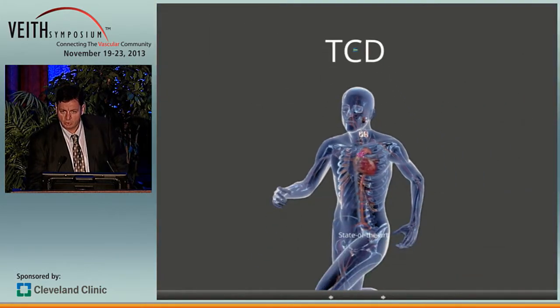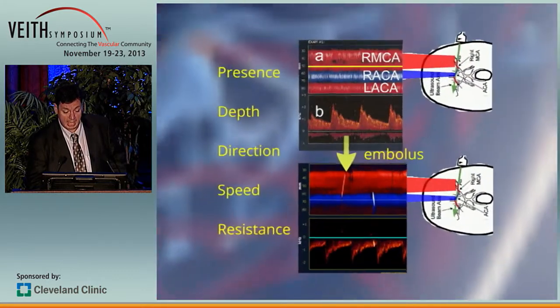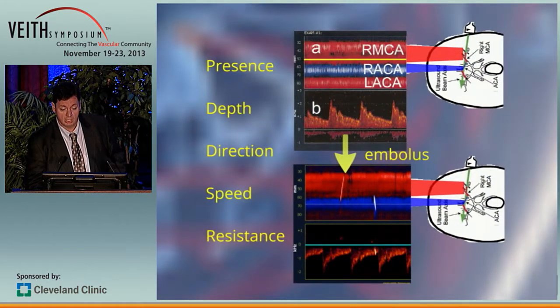I would like to take you on a trip around your brain, and what I would like to show you is our fancy transcranial Doppler signals and some brand new video recording, which you probably haven't seen in an operating room if you haven't paid attention to the TCD screen.